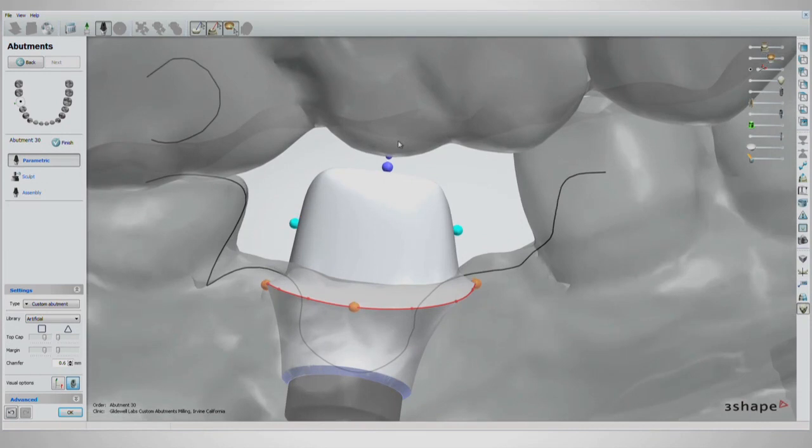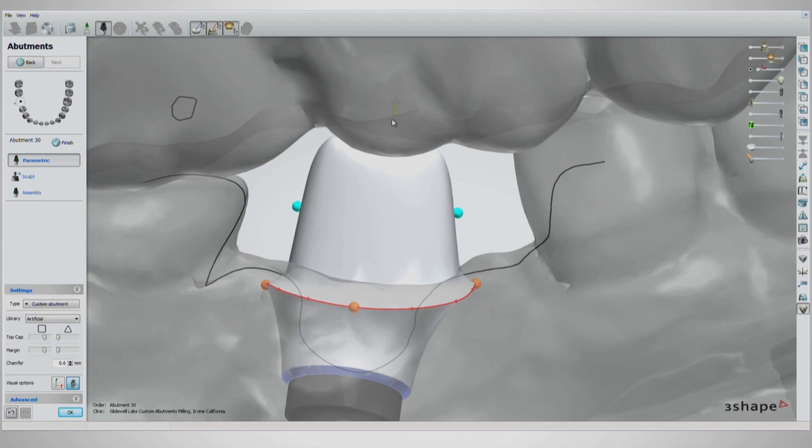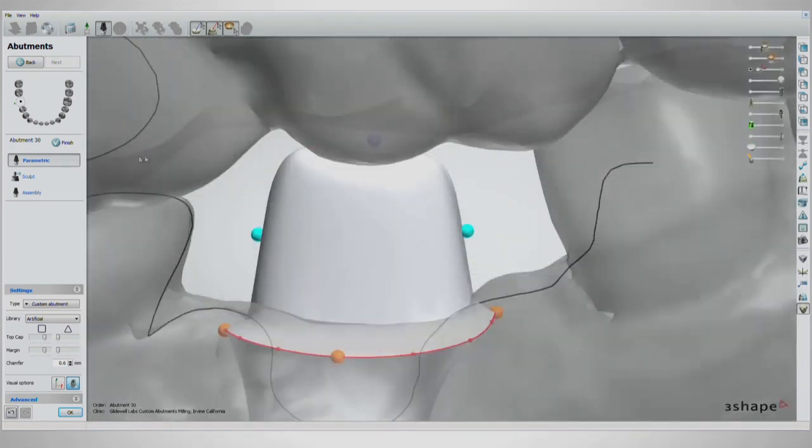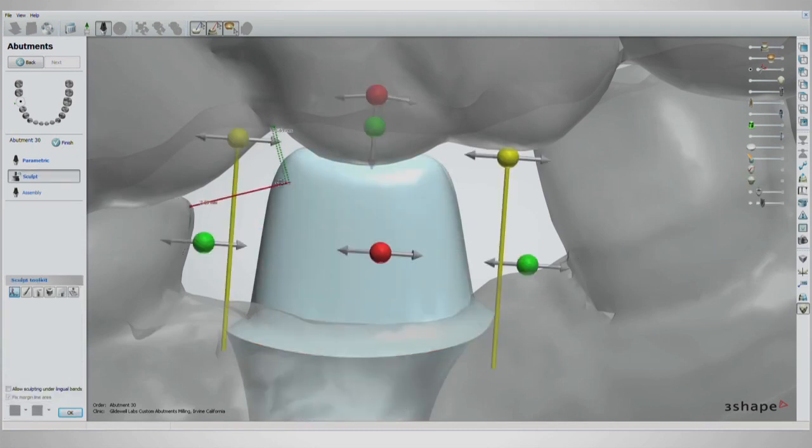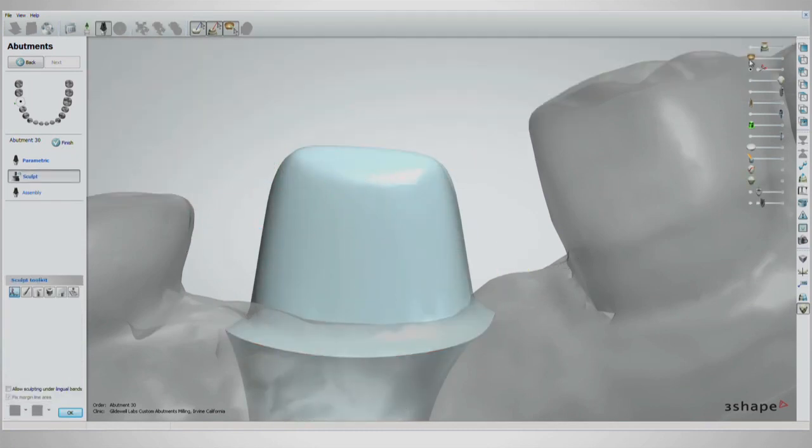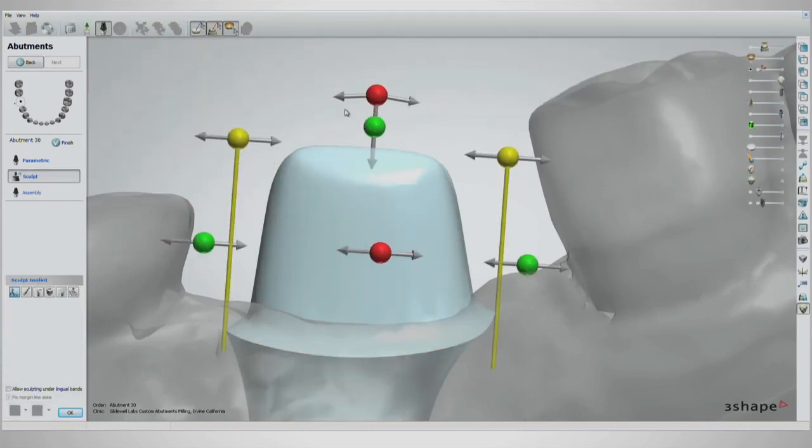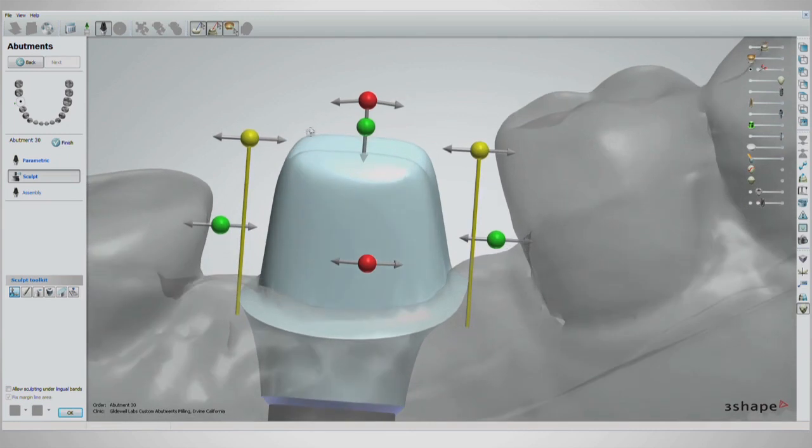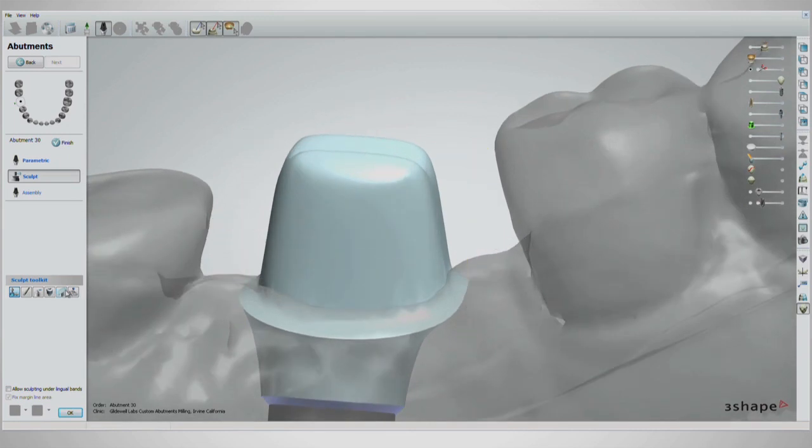Before moving from the parametric stage into the sculpt stage, it can be beneficial to make the abutment taller than needed with a large purple handle. After that is done, enter the sculpt stage and slice the top of the abutment off to create more room if you prefer a flat top as opposed to the standard V-cut design.